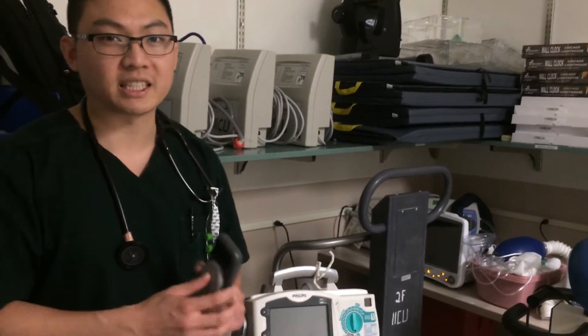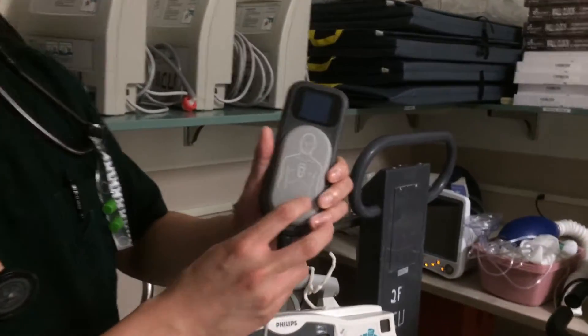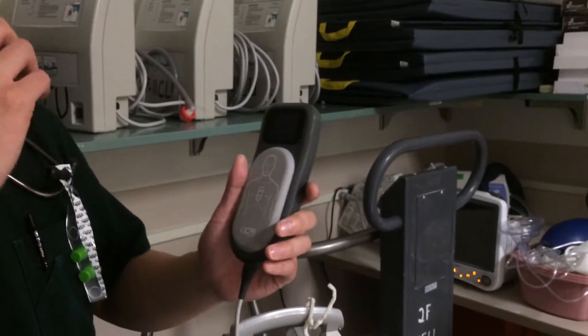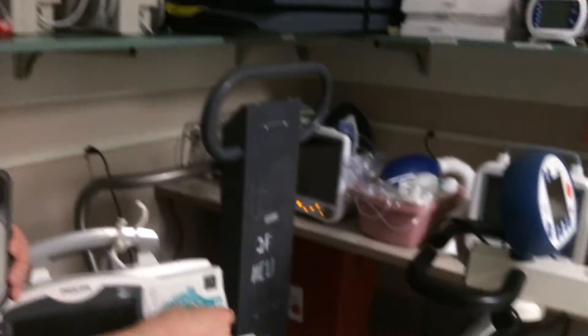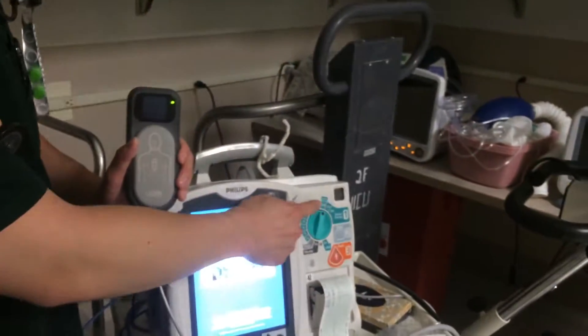When you attach it to the patient, you ideally want to attach it right between the nipple line. Preferably the bottom of the puck is a little bit above the xiphoid process, so you don't break it. Then you start attaching it to the patient and automatically turn the defibrillator up to 150.